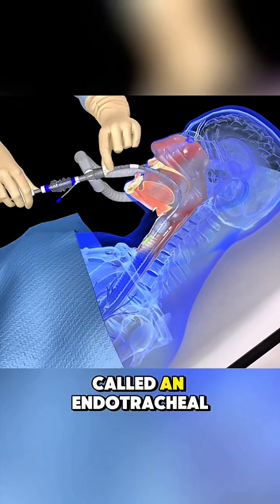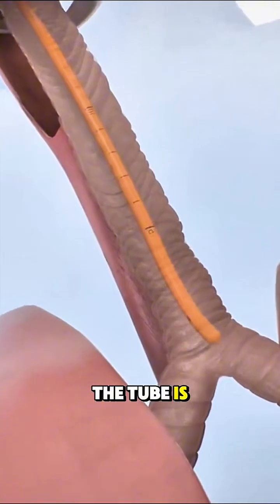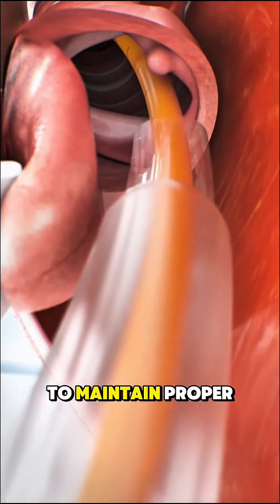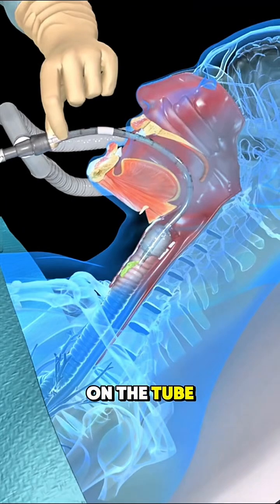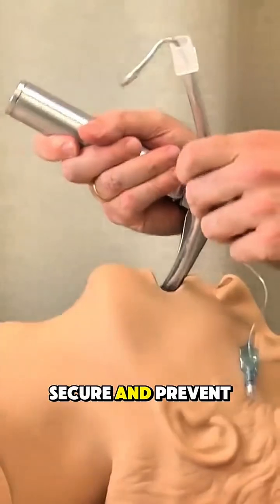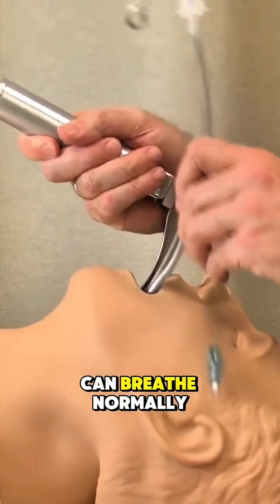This tube is called an endotracheal tube. Once in place, the tube is connected to a ventilator or oxygen source to maintain proper breathing. A small balloon on the tube is inflated to keep it secure and prevent air leaks. The tube stays in until the patient can breathe normally again.